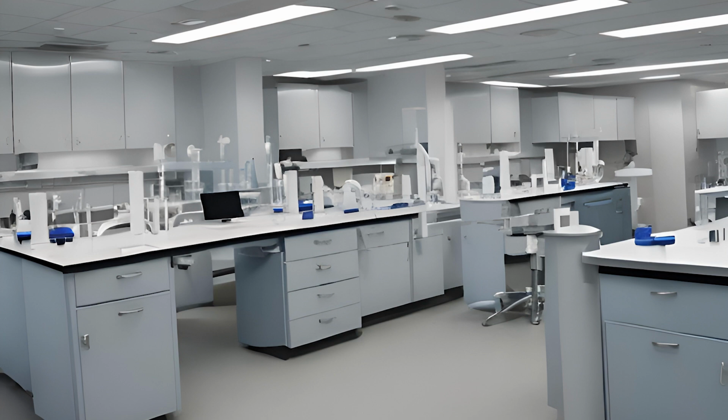Step 2 is going to be to approach, identify, and prepare your patient. If it's an inpatient environment, and that means somebody who's staying overnight in the hospital, they'll usually have their own room. The things you're going to look for are signs on the door or in the room for information concerning which patient is in the room. Of particular importance are signs that may indicate certain infection control precautions, such as droplet or airborne or contact precautions, or if that person has a latex allergy.